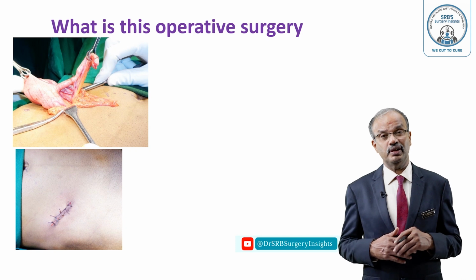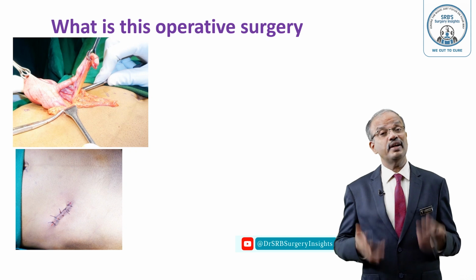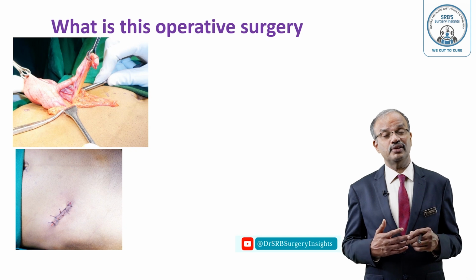Indications are acute appendicitis. Ideally, laparoscopic appendicectomy is the ideal thing. In a situation where it is not good, for example a critical patient who can't afford it, mainly there is the indication in a peripheral center. You can do this one under spinal or general anesthesia quickly.